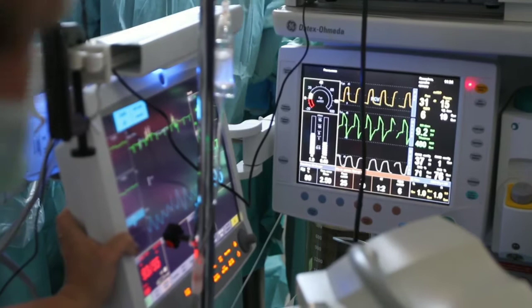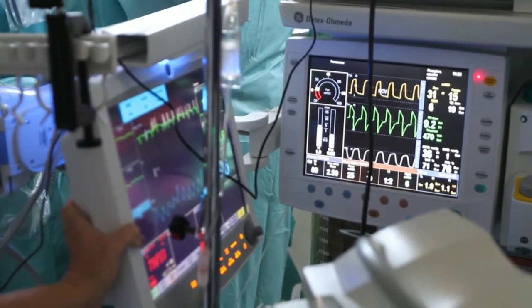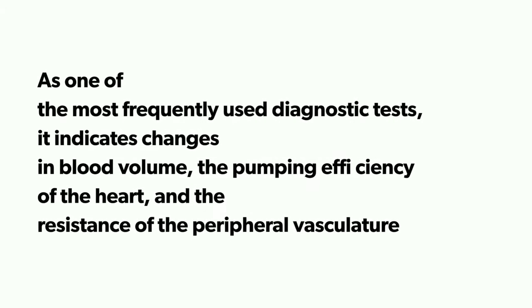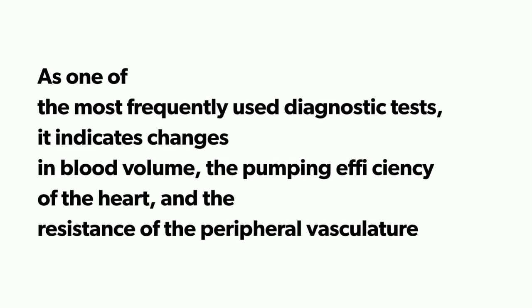Blood pressure monitors, generally NIBP monitors, non-invasive blood pressure monitors. NIBP is an essential indicator of physiologic condition. As one of the most frequently used diagnostic tests, it indicates changes in the blood volume, the pumping efficiency of the heart, and the resistance of the peripheral vasculature.